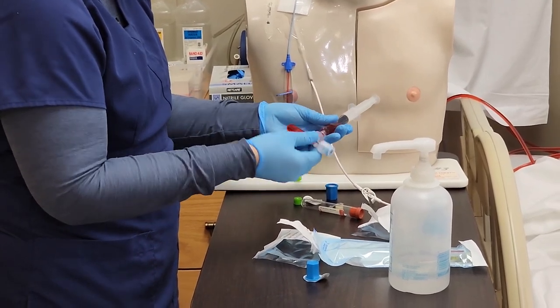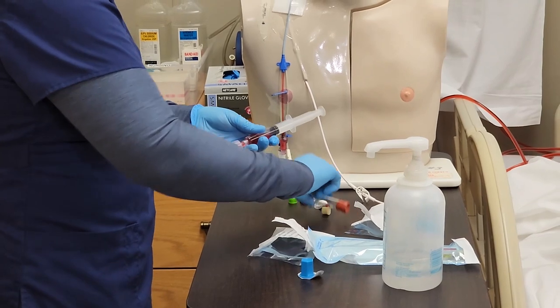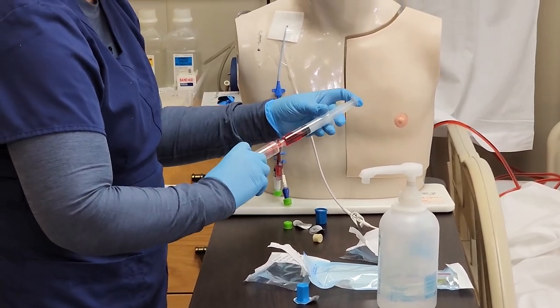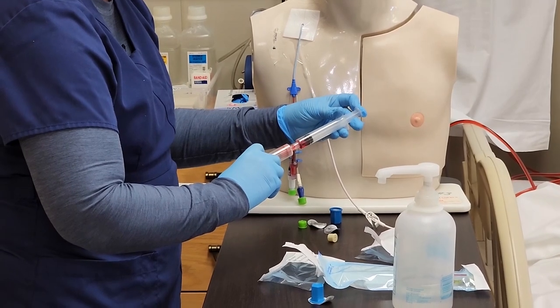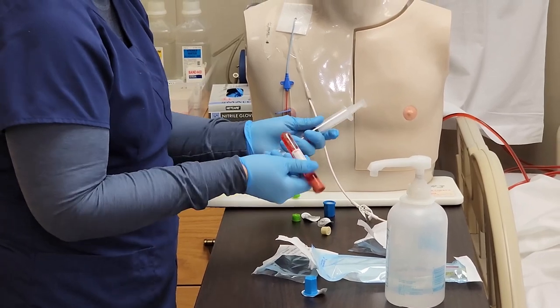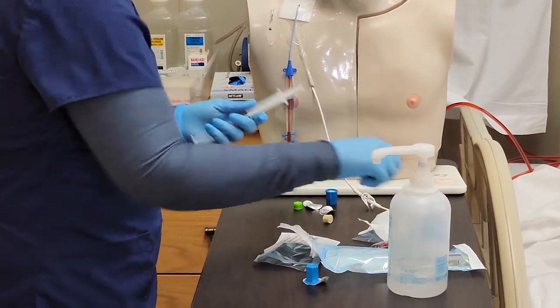I take out my sterile vacutainer and the blood tubes I need, and transfer the blood into them. I fill the first tube up, remove it, and invert. Then I take my other blood tube, put it in, fill that up, remove, invert, and discard.